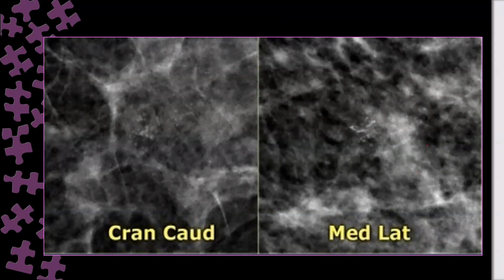predominantly. Can you tell exactly which particle look like? It is hazy. Do you agree with me? It looks hazy. It looks like crushed stone. Agree? It looks like a hazy, not very clear, not very sharp.